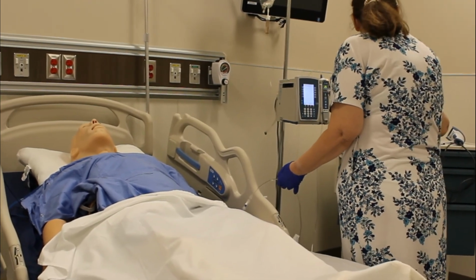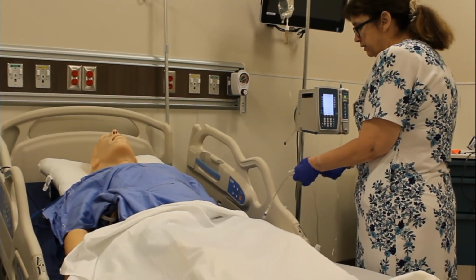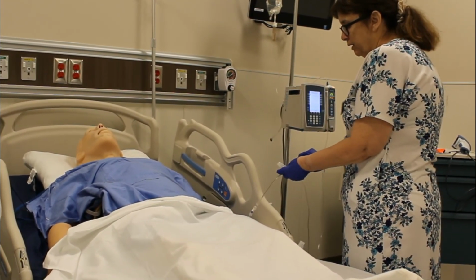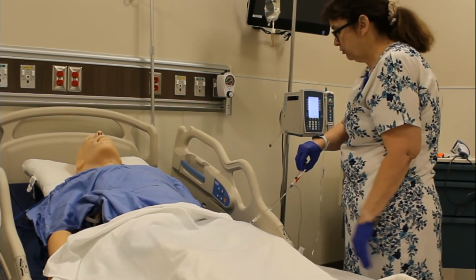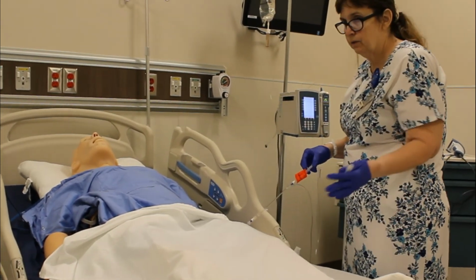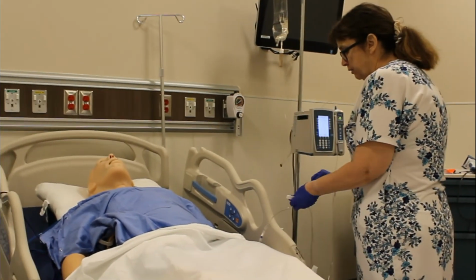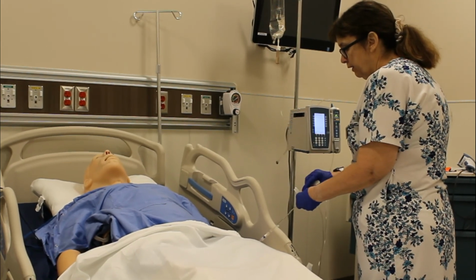Okay, and I'm going to go ahead and give the furosemide. Now furosemide I give at 10 milligrams for every 30 seconds, and I have 4 mLs in my syringe. So I'm going to give it, look at my watch, wait about 30 seconds, give the next mL. I'm not going to take the whole 2 minutes, but it should take 2 minutes to give. Disconnect, and then I'm going to flush. All right, and that is that.